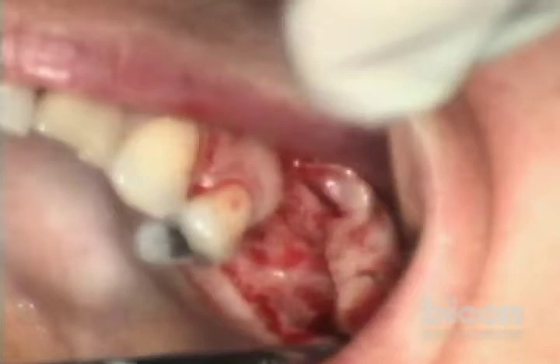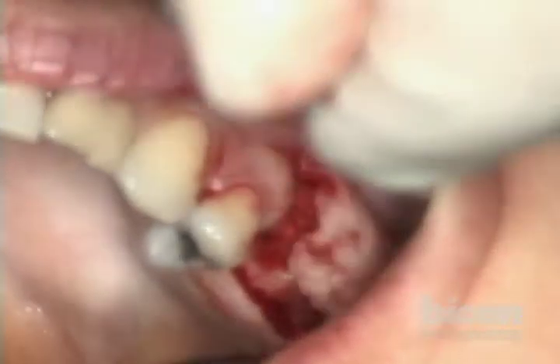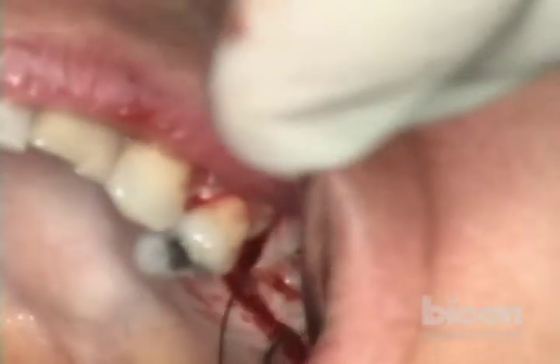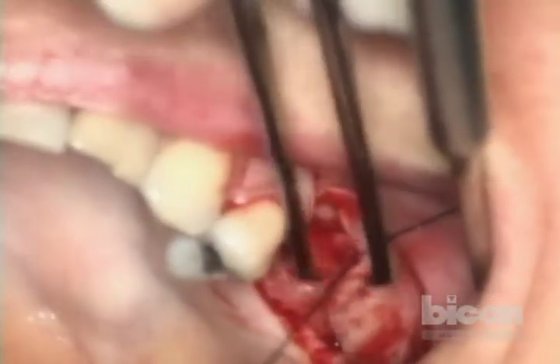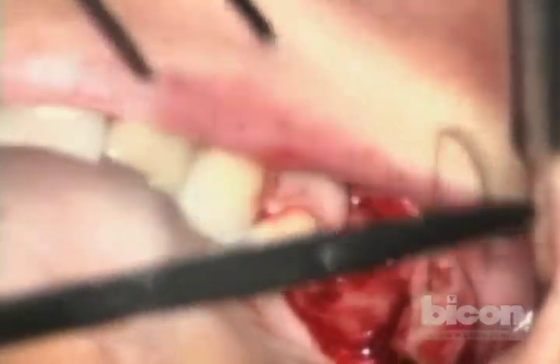We will use a retraction suture whereby the flap is maintained open without our having to chase it all the time. Since there is a tear, I'm going to first protect that tear so it doesn't propagate — by putting a suture temporarily in there. Little details can make a case go a lot smoother.